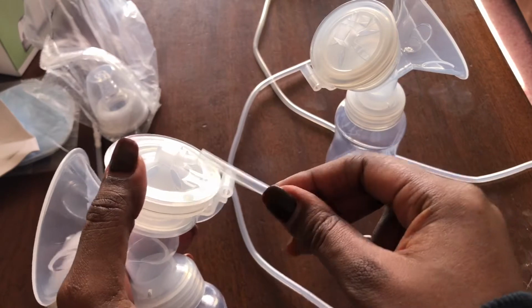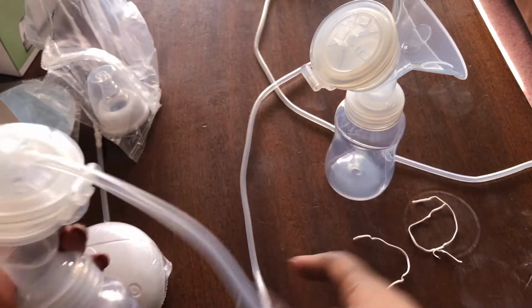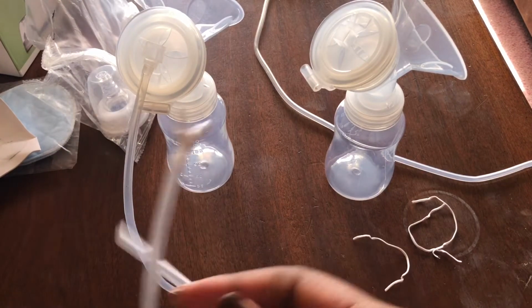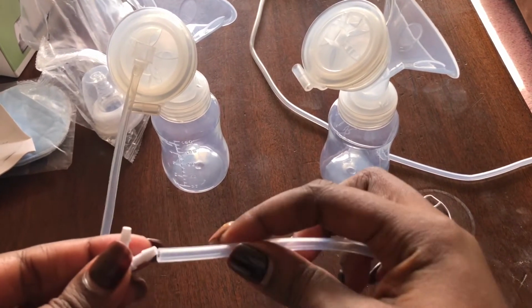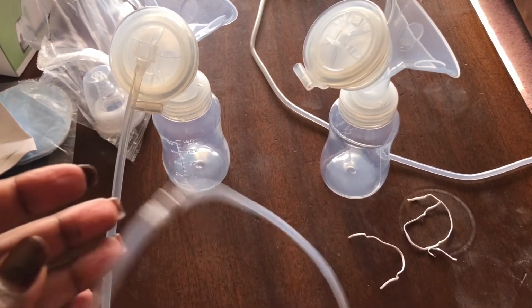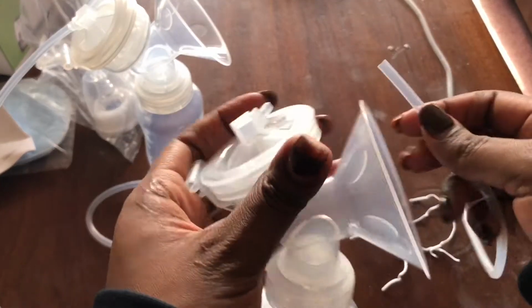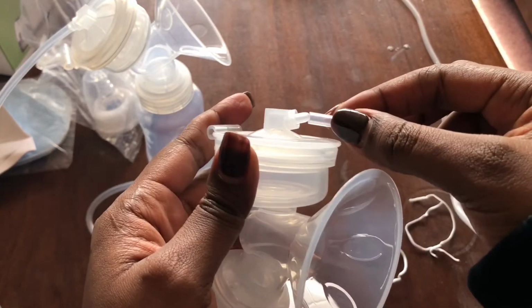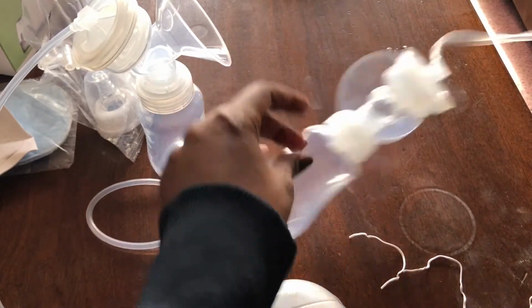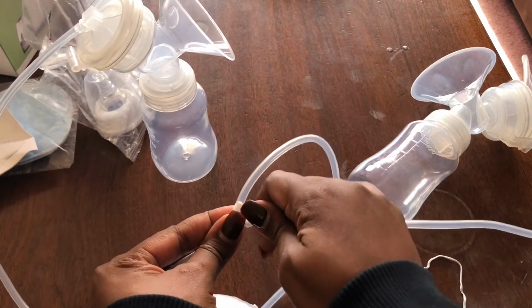So this end comes here like that, and the other end of this pipe comes here. It comes here. Then the same thing that you've done to that part, you do to this bottle. So you do the same exact thing. Then you connect it to this part like that, and then that's it.